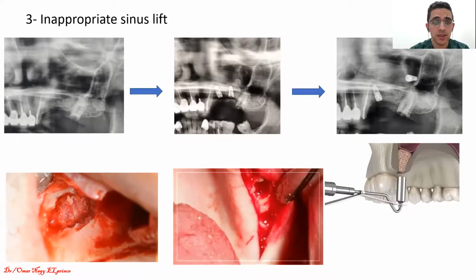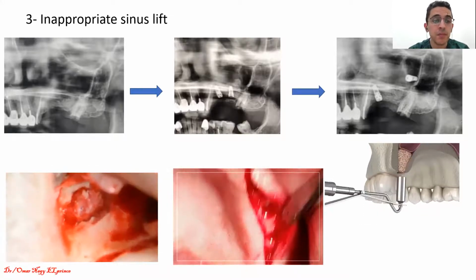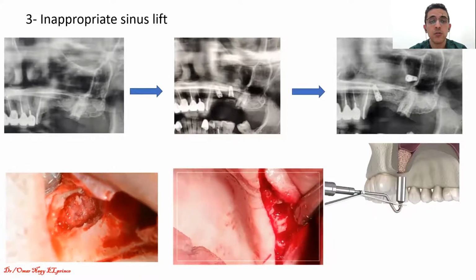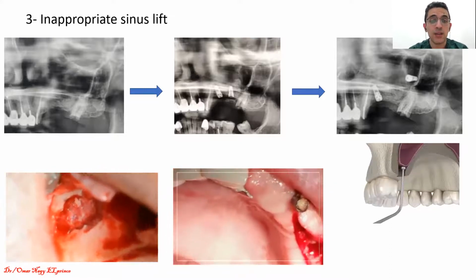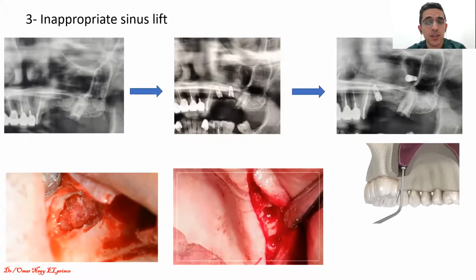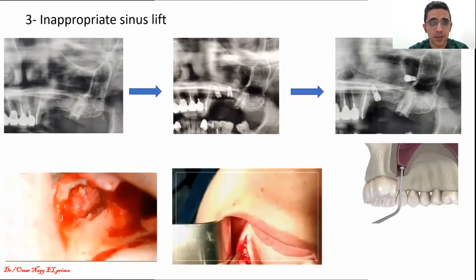In both ways, أنا دايما ask my patient, I always tell my patient, please take a breath, please take a breath, and then check the membrane as it goes forward and backward, or if it comes up and down with the crestal approach. So you have to check the integrity of the Schneiderian membrane, and make sure that the Schneiderian membrane is not perforated, because a perforated Schneiderian membrane will lead to a compromised implant, which will lead eventually to a displaced implant into the maxillary sinus.